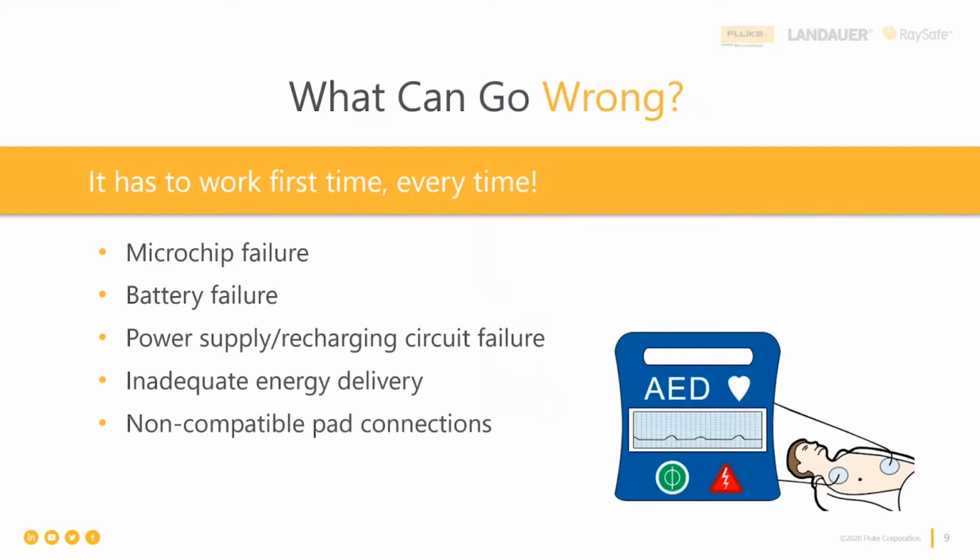Or monitor them. Yeah. So AEDs, just to kick this one off, AEDs are wonderful. They are automatic external defibrillators. They are designed for a first responder who really doesn't know anything about the physiology of a patient to be able to successfully deliver a life-saving shock so that the chances of the patient surviving a cardiac arrest, a heart attack, are higher. And AEDs are very special little devices because they have to know how to interpret the ECG and the arrhythmia, because the first responder that's going to use them doesn't know how to.